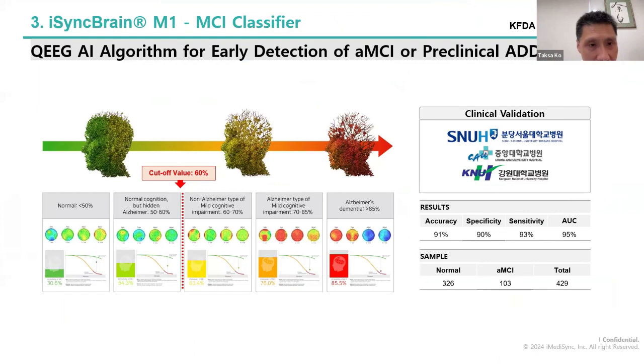As you said, so cutoff value, it means, can we, on the basis of that result, diagnose a mild cognitive impairment or not?